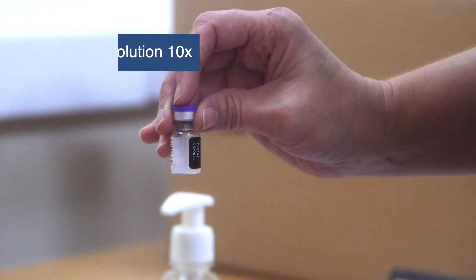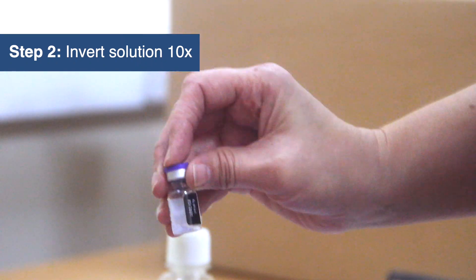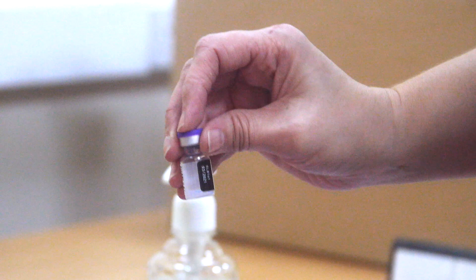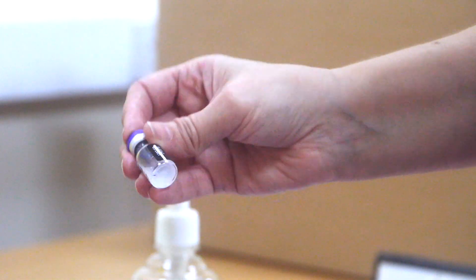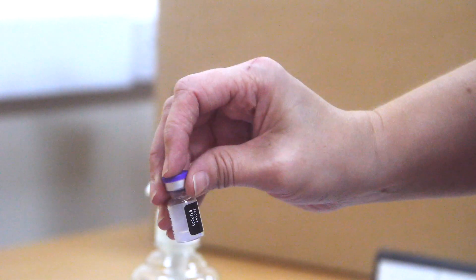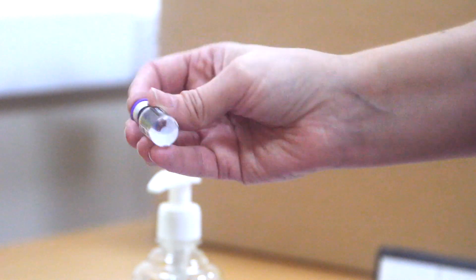This solution now needs to be inverted 10 times gently in order to mix it. Invert the vial counting to ten: one, two, three, four, five, six, seven, eight, nine, ten.